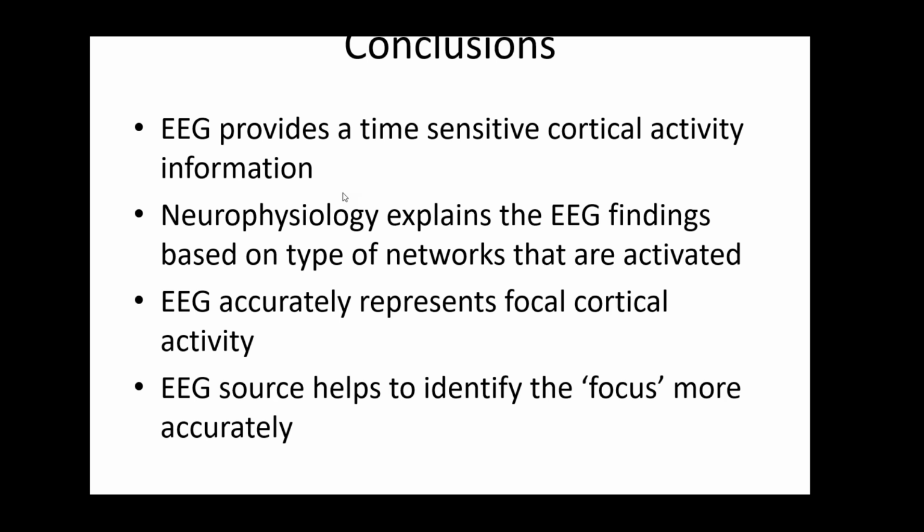The dipole model uses a vector that has a direction, which is an advantage over sLORETA in that it gives you directionality. The direction is where you get the head of the dipole, where you get the polarization, where you have the negative and the positive end of the dipole, which is the direction of the action. So it gives you an idea of the directionality of the potentials.